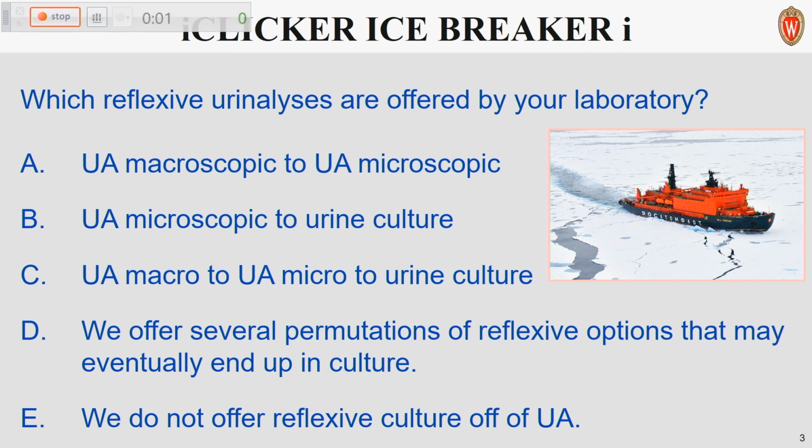So macroscopic is your dipstick, essentially, with the multicolored pads, two of which we'll talk about later on. And I'm so glad that I'm working with Heather because I don't have to futz with the iClicker at the front. I am so happy about that. Way to go, Heather. You've seen me work with that iClicker before, and it's a disaster.